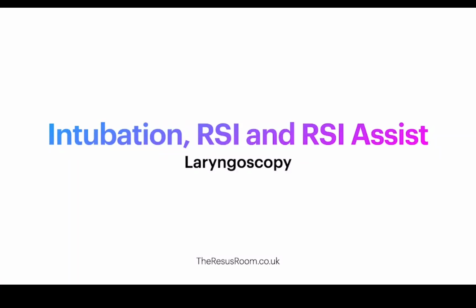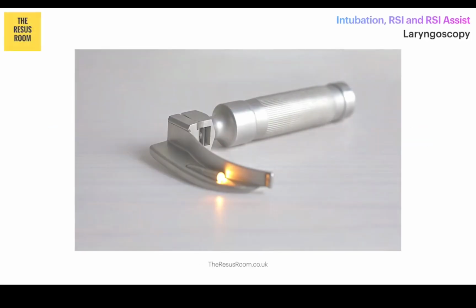Right, so we're down to the nitty gritty now. It's time to intubate the patient. Now, whether this is in cardiac arrest or in the context of an RSI may affect the position that we can get the patient into. But the technical process of intubation remains really similar, with the teamwork being absolutely key.